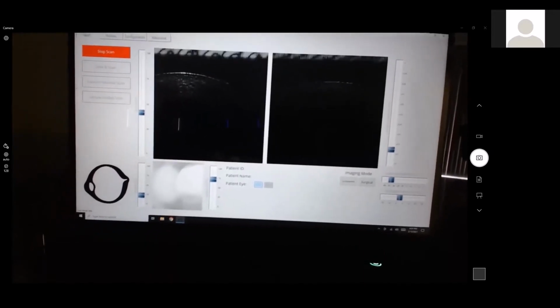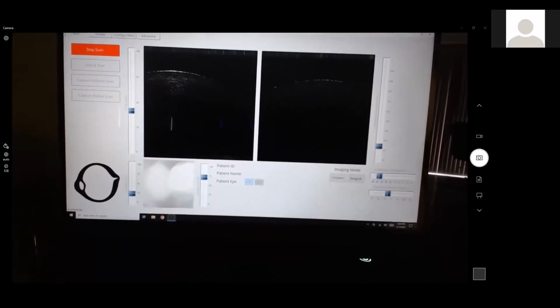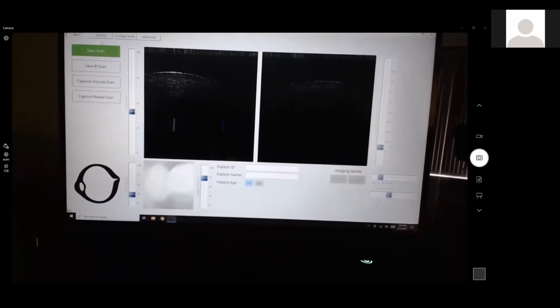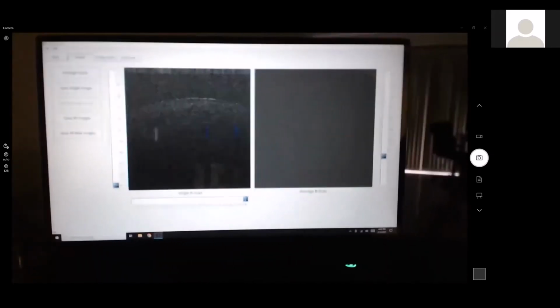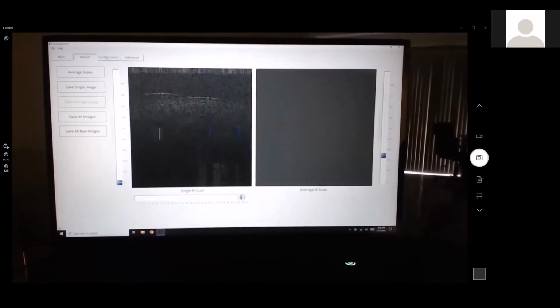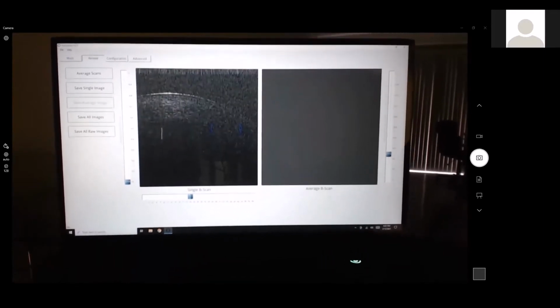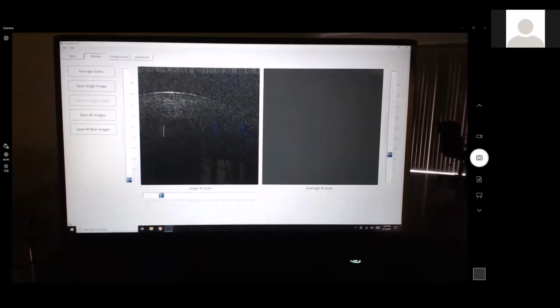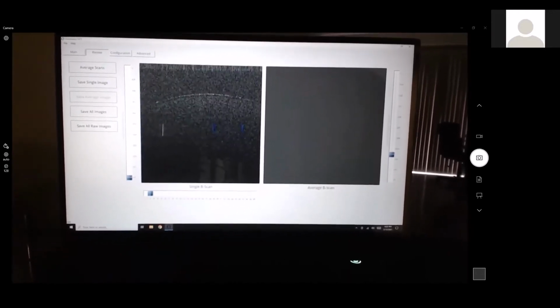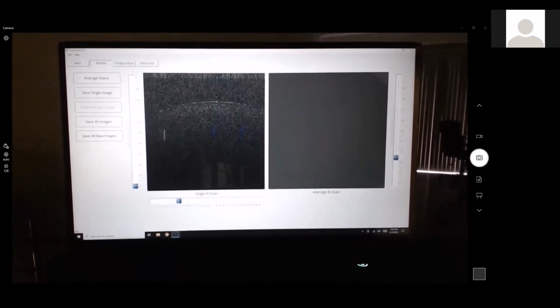So once again, if we collect a bunch of these images by hitting stop, now we can go back and review and increase the signal on the left, bring that down and then go ahead and scroll through. You can see that every other image is bouncing back and forth. So one of the things we could do is literally save all those images, and later we could take out the half as one side versus another.